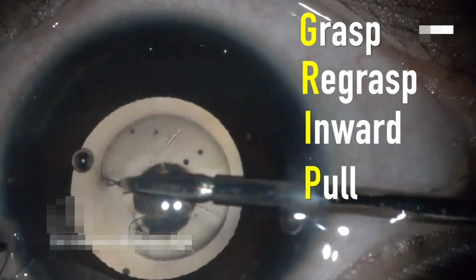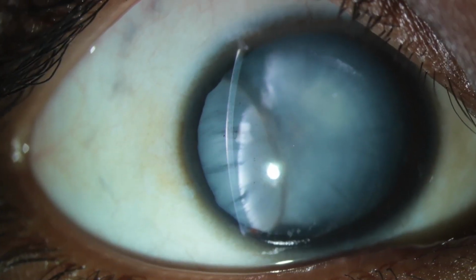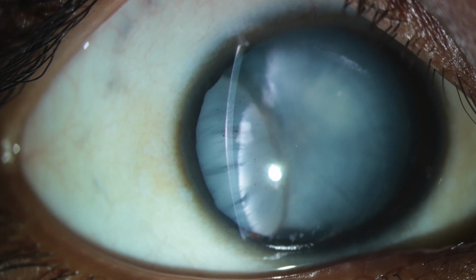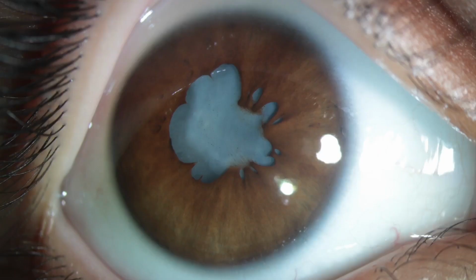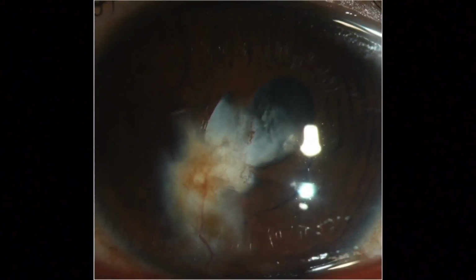This technique has a steep learning curve and may be difficult in conditions where the morphology of anterior capsule is compromised, such as in trauma, presence of a plaque, subluxated lens, and/or associated with anterior segment pathologies.